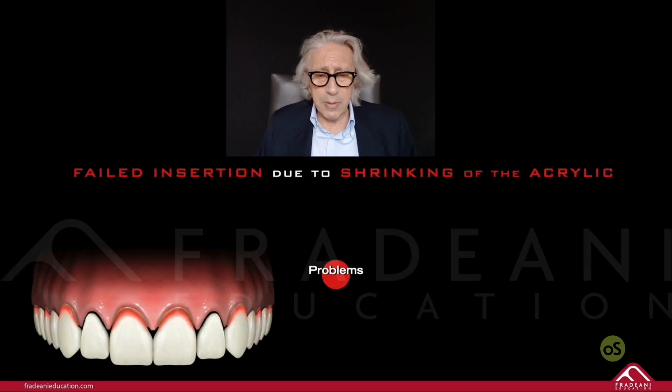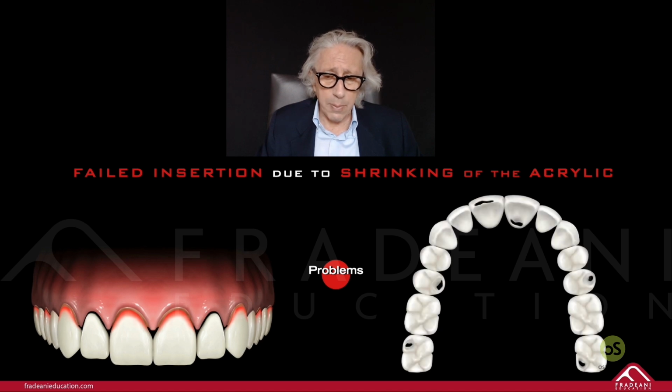I want to explain to you rapidly, if you don't know the technique, how you do it, because many times when you use an acrylic shell to reline in the patient's mouth, you have the chance to see that the patient will have a problem. I mean, not the patient, the dentist will have a problem in inserting a large case like this, like an upper arch. Why? Because of the contraction of the acrylic, you're not able to really put your shell completely in. That's the problem. So you start to open the hole again. You start to open the inside part to try to be able to fit it, but it's very complicated.